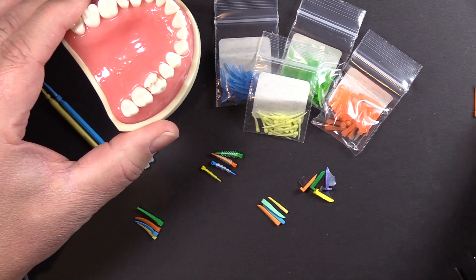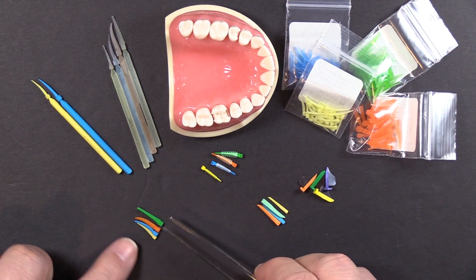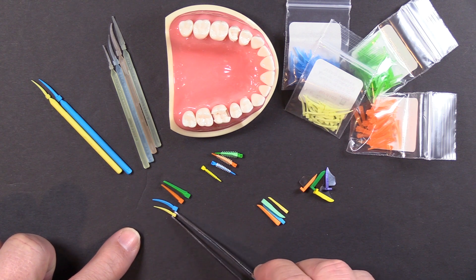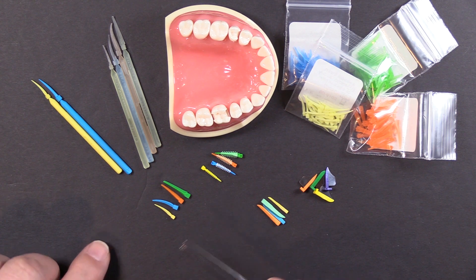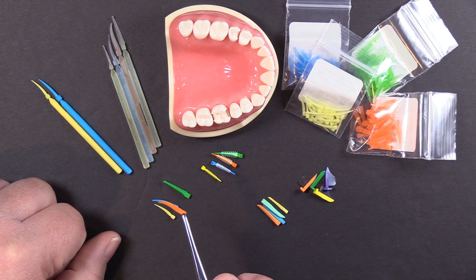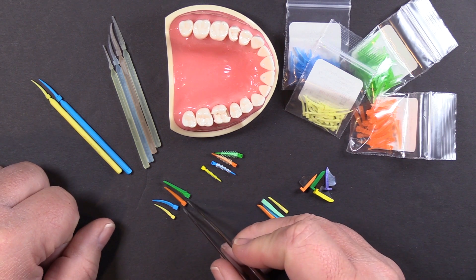That covers Wedge Wands. G-wedges are wedge wands without the handles — that's all they are. Exactly the same wedge design and same material, just designed for traditional placement for people who didn't want the handle.